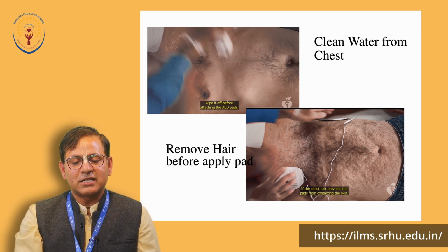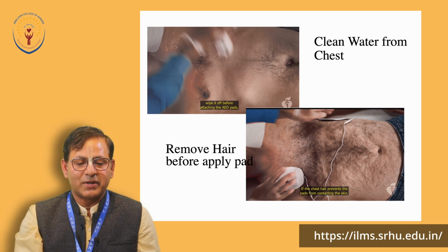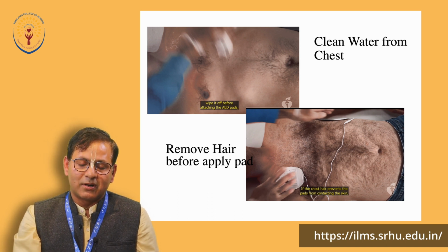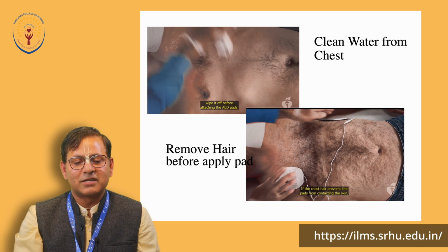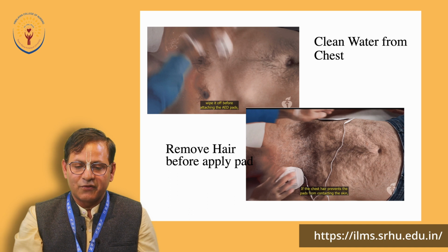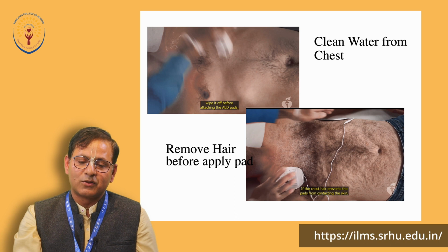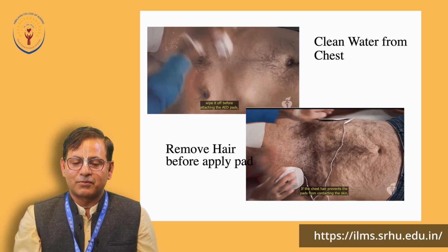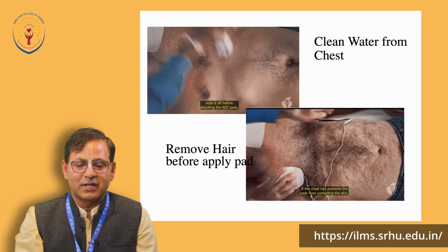Another condition: if the client has too much hair on the chest, what can be done? It is better to remove the hair before applying pads, because if the chest hair prevents the pads from connecting to the skin, there will be no proper shock for the client and it will be a waste. So if there is a razor, we can shave it, or if a shaving kit is there we can utilize it. Or if you have two sets of pads, first you apply one and suddenly remove it, so some hair can be removed, and the second pair you can utilize for giving the shock.